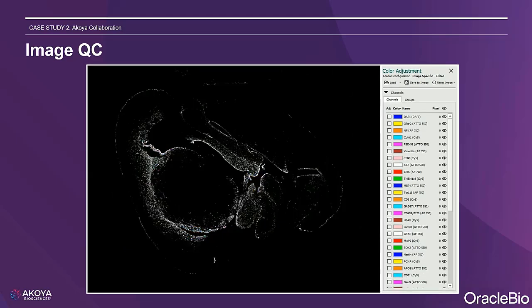Here we can see an example of visualizing a single marker, GFAP, for identifying astrocytes, which we reviewed in order to assess the best analysis strategy for such markers. In the case of this project, assessing GFAP indicated it may not present the most optimal case for object detection and segmentation due to the density of the cells, which indicated the requirement for a different strategy, which is discussed later in the presentation.